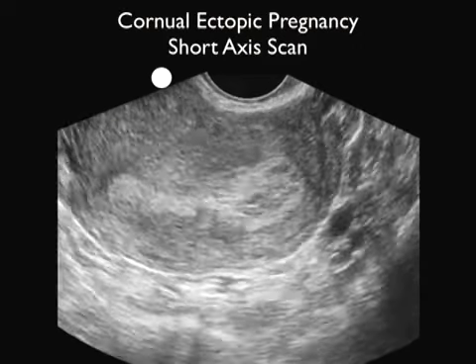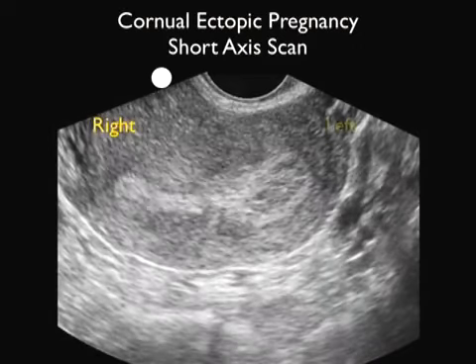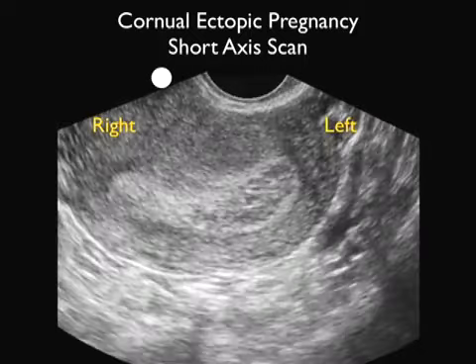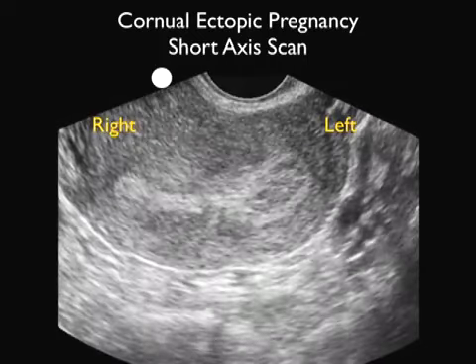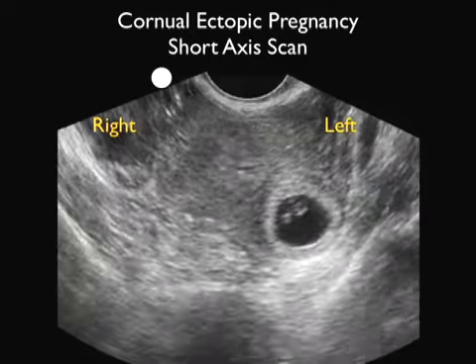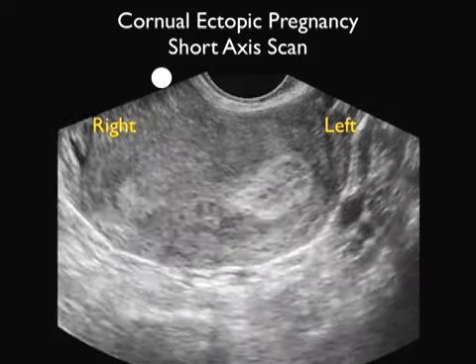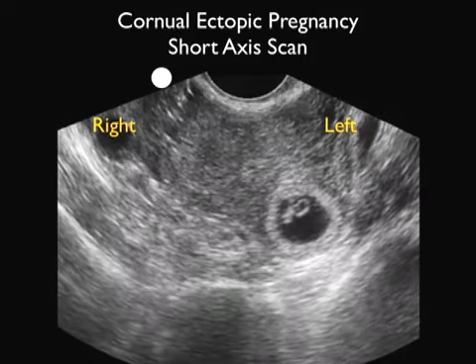Here's a bicornuate uterus in short axis configuration, marker dot over towards the right. As I scan up the limbs of the bicornuate uterus, I see 2 limbs of endometrium indicating the 2 cornual limbs. But when I look in the leftward limb, I see the presence of a cornual ectopic pregnancy. And here we'll go ahead and still that down.